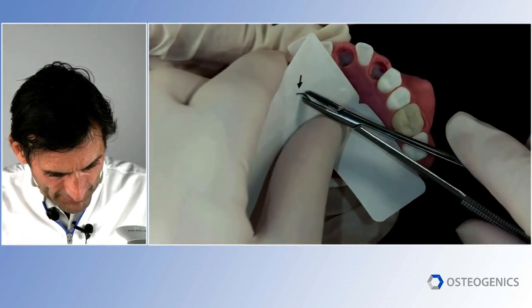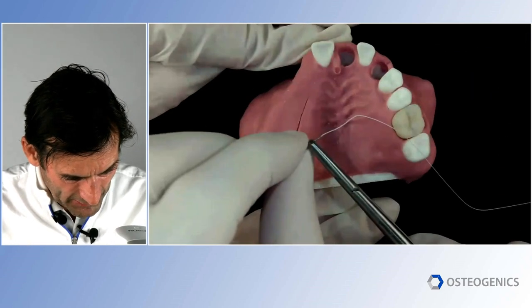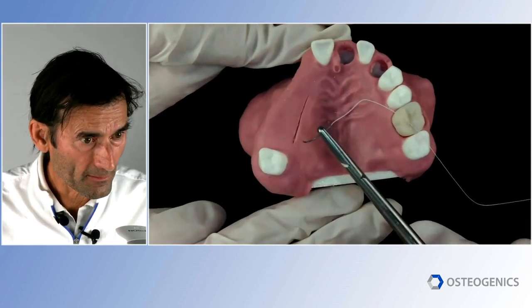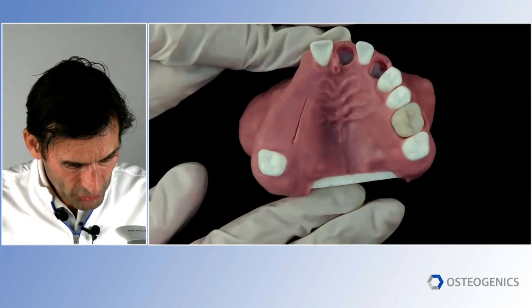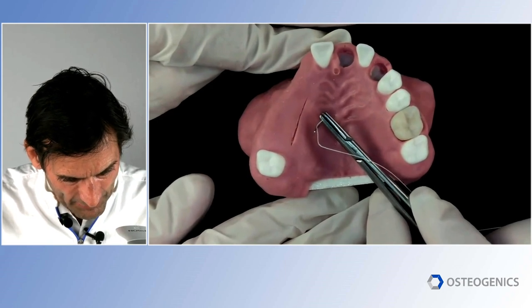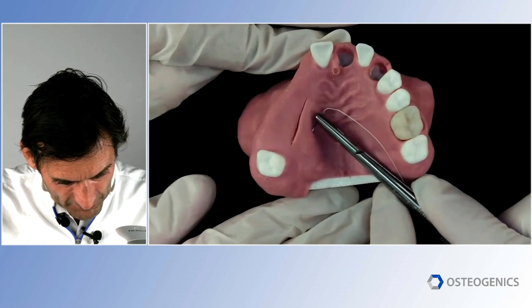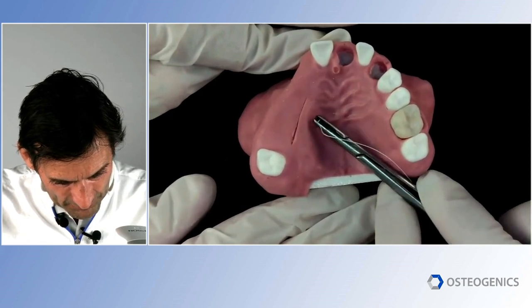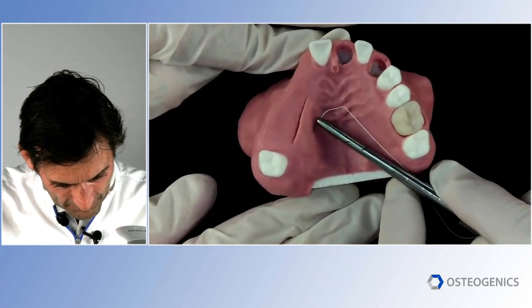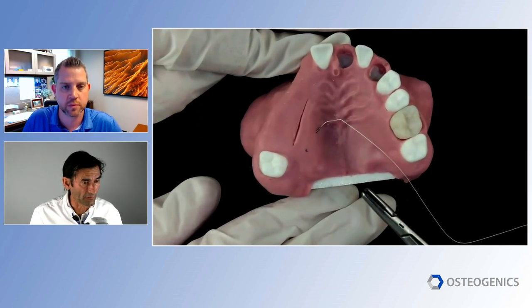When I grab it, I don't grab the needle at the end of it. I always leave a couple of millimeters free. You can see that? All right, so that's good. Now I'm going to show you my suture technique. It's going to come in and go apical to where I removed the connective tissue, and come out. I'm a little bit restricted here by the camera, but you can see the in and out, right?